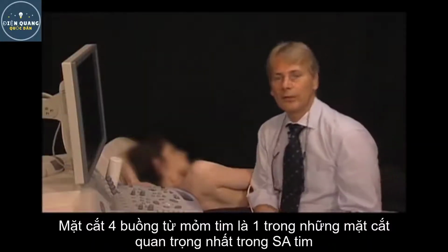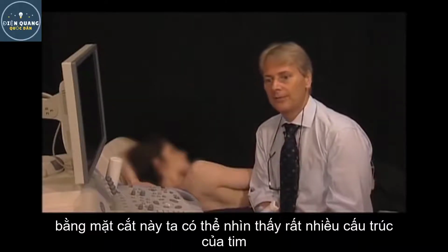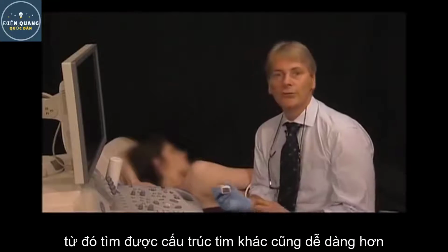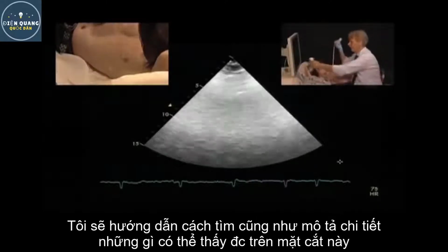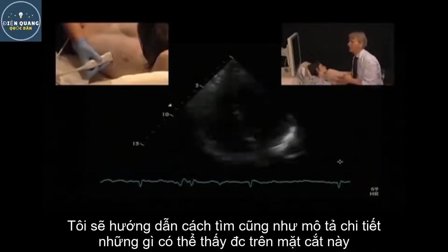The four-chamber view is probably one of the most important views in echocardiography. First of all, it's a view where we see very many structures, and it's also a view from which we can find all the other structures more easily. So I'll show you how to orient the view, and then also which details you can depict.